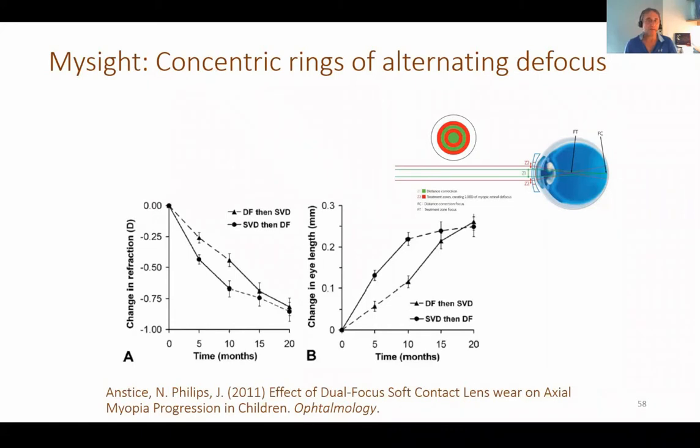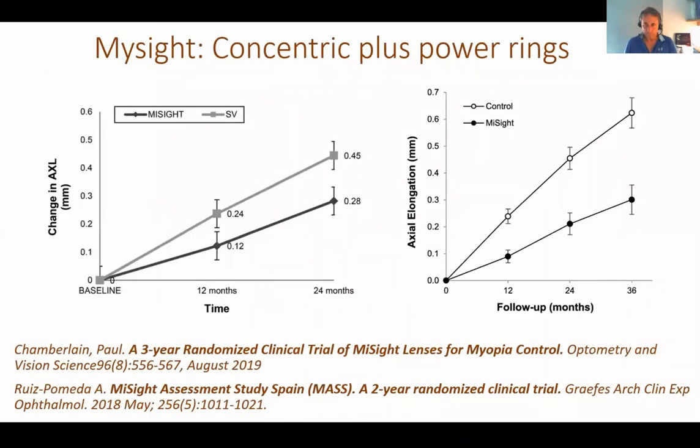And that was the promising result at the beginning that led to two other studies, by Ruiz Pomeda, Alicia in Spain, and Paul Chamberlain. And you can see here that the results are really beautiful. The study continued for 2 years, and continued to show us that results are consistent along the time. And then they stopped wearing the lens and saw what happens. So it's really, really good job made by CooperVision there.